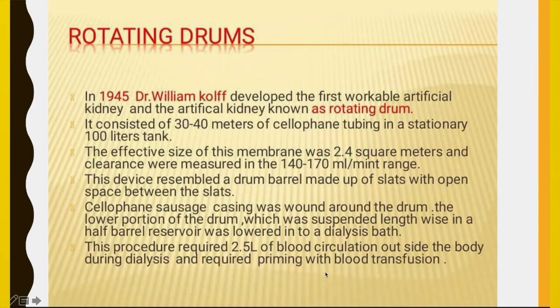Next, the dialysis required priming with the blood transfusion. So for starting this dialysis treatment, we have to prime it with the blood transfusion. So we have to always prime it with the blood. So this was a brief history about the rotating drum dialyzer, which was developed by Dr. William Kolff in the year 1945.